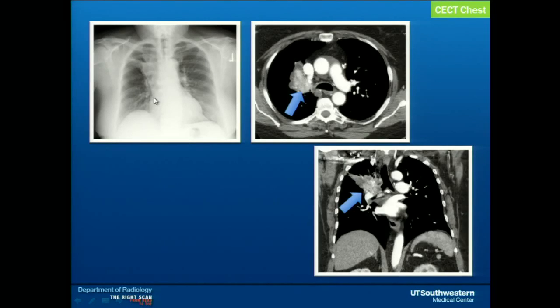This particular patient had shortness of breath, dyspnea, and weight loss, and the chest X-ray showed a right upper lobe mass. For further workup of this mass, contrast-enhanced CT scan was obtained, which shows a hypervascular mass. You can see the vascular mass on the coronal images with some distal atelectasis and an endobronchial extension. And a diagnosis of a vascular tumor like carcinoid was suggested.